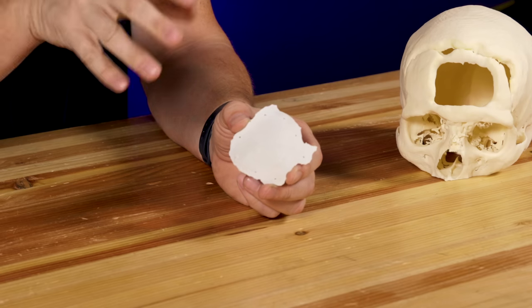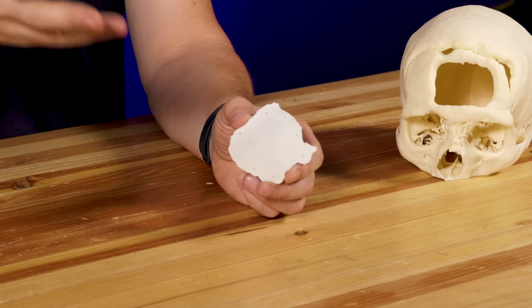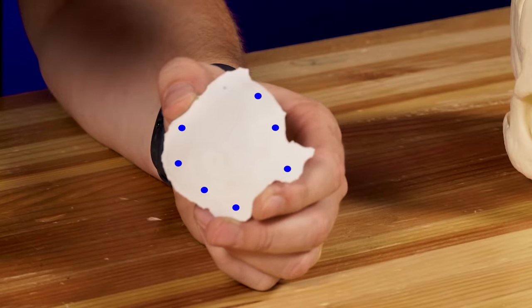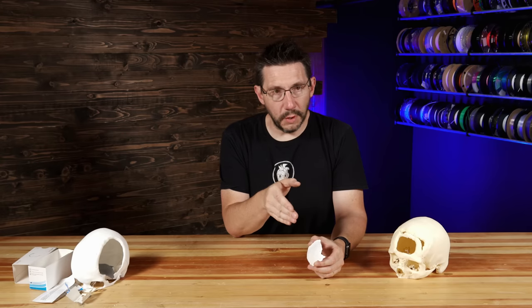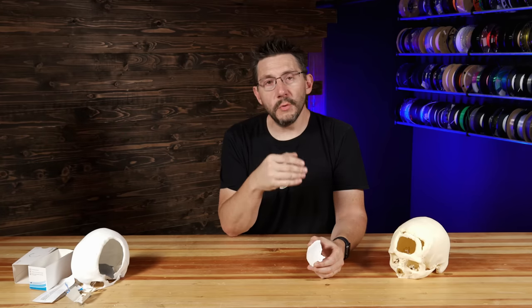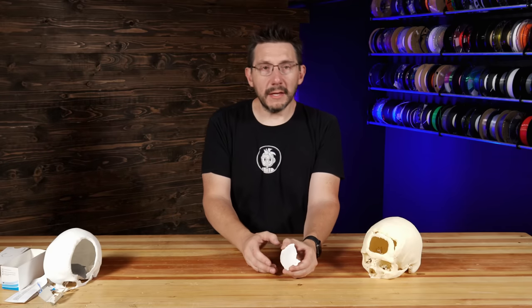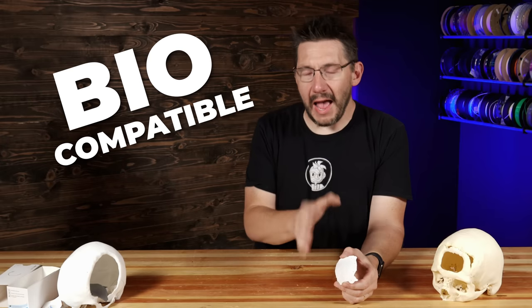Look at it — it's got a mesh built into it from the geometry, and it also has the holes built into it for the sutures to go through. And if you remember, ceramics aren't something that you can reshape or reform after the fact — you need to build everything into it when you print it.